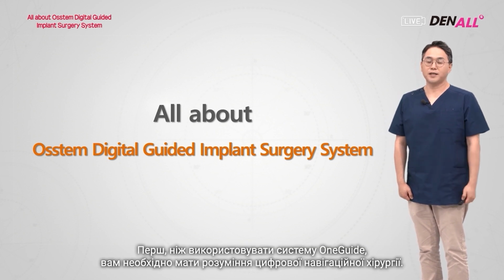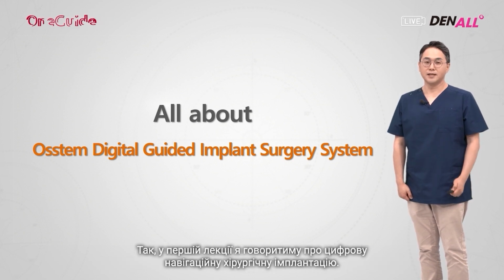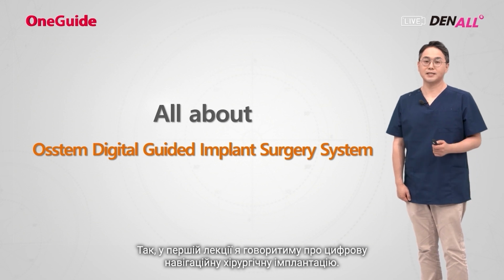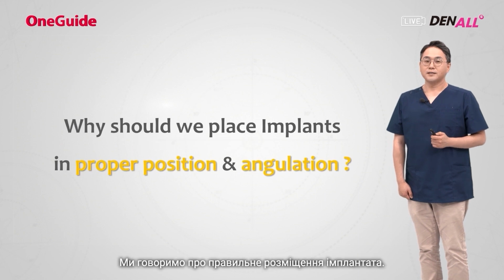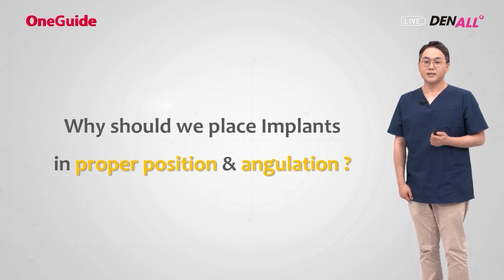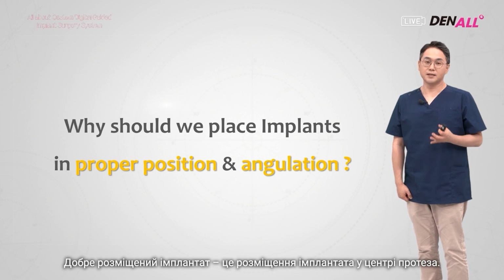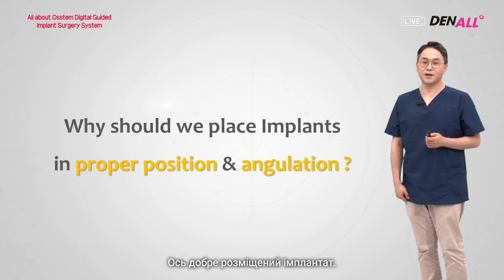First, you need to have an understanding of digital guide surgery to use OneGuide. So in the first lecture, I'm going to talk about digital guide implant surgery. This is the introduction. We talk about placing implants well. What does this mean? A well-placed implant is placing the implant at the center of the prosthesis. This is a well-placed implant.